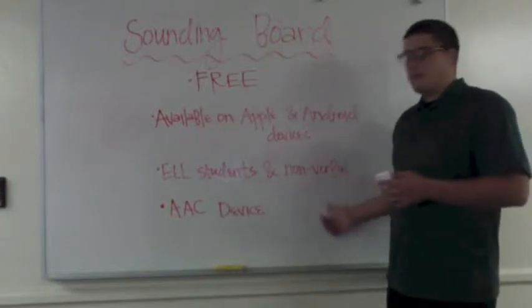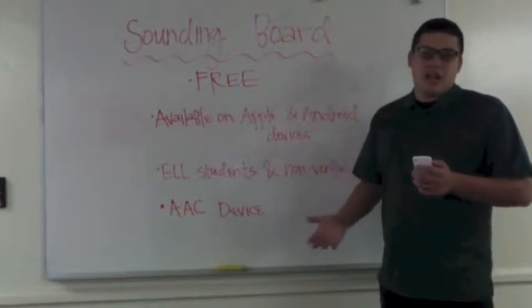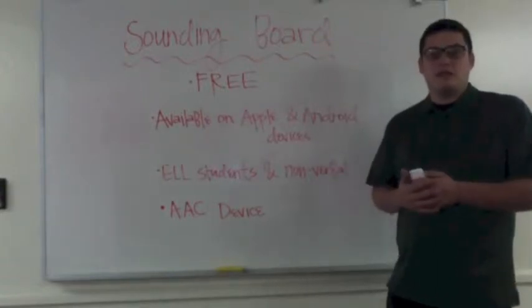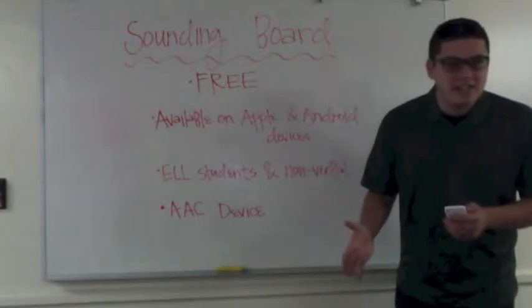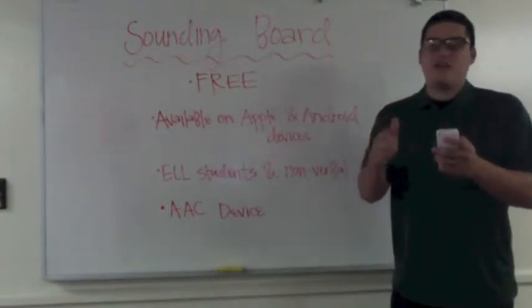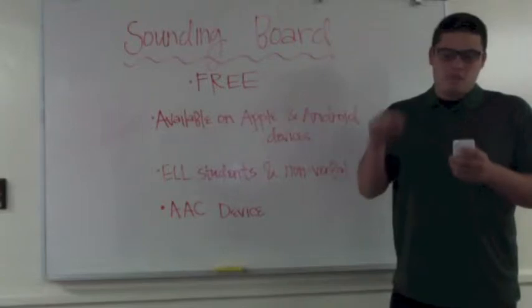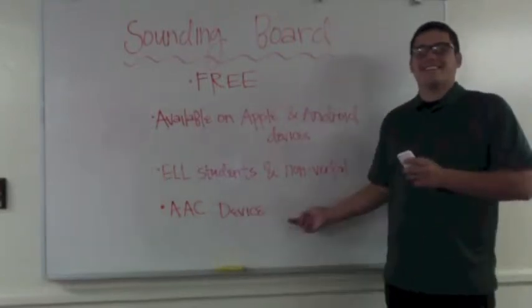This is nonverbal for speech that is sometimes not understood or hard to understand. It's also for those coming to a new country who don't know the language. And it is also an AAC device. What is AAC, you might ask? Well, according to Google, AAC is augmentative and alternative communication, and it is used by people who some of the time or all the time cannot rely on their speech. That is what AAC means, and that is what Sounding Board does.